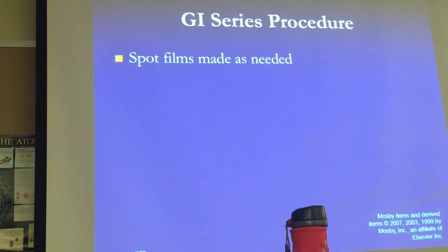You still use the fluoro too, but you switch it. The technical factors are changed. In fluoro, you're going to be using... well, let's leave it at that. Next time we'll talk about it.